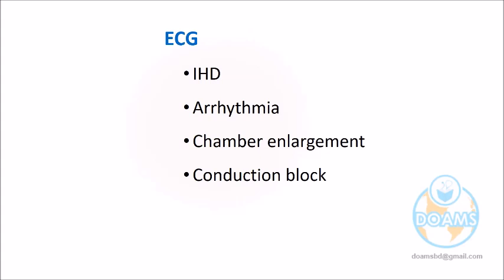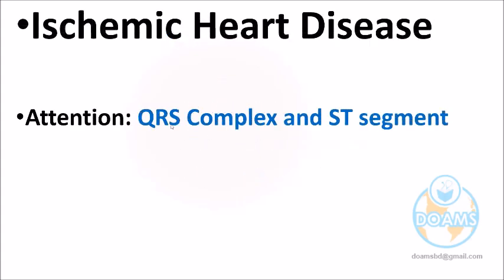Anyway, perspective is different: ischemic heart disease can also be complicated by arrhythmia, but arrhythmia per se is the most dangerous ECG finding, and a patient may die within minutes. Conduction block, if it is complete heart block, may be dangerous, but patients with complete heart block die within days or later, and occasionally escape from the rhythm problem. But arrhythmia, such as ventricular tachycardia and ventricular fibrillation, is the most dangerous. Anyway, we can start with ischemic heart disease now.